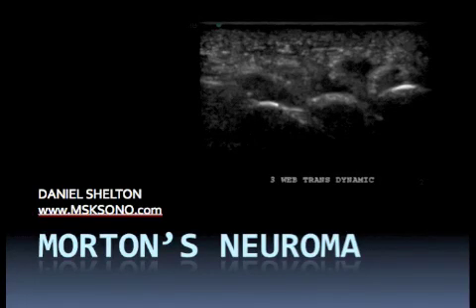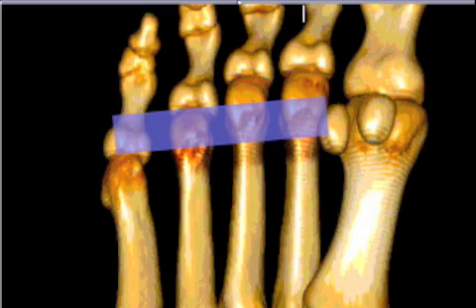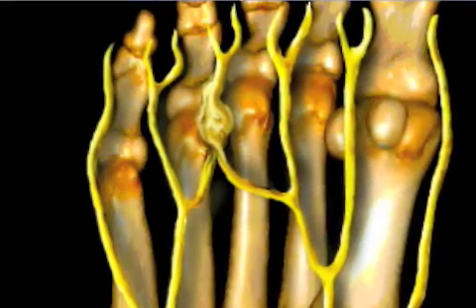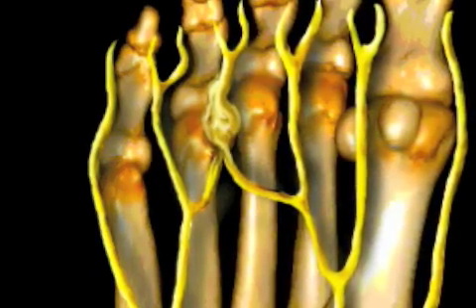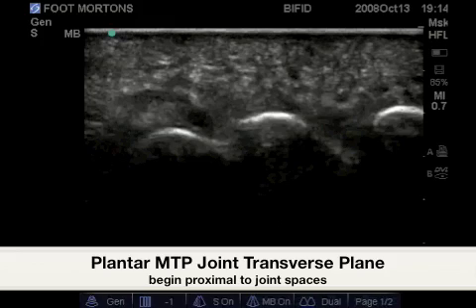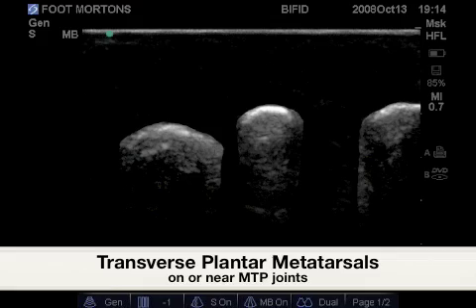The following study is imaging of the Morton's neuroma anatomical landmarks. Here is a transverse image over the plantar aspect of the MTP joints, just proximal to the articulating surface. In this illustration, we see a bulging of the interdigital nerve at the level of the third and fourth MTP joint, with a hypoechoic space representing a Morton's neuroma.